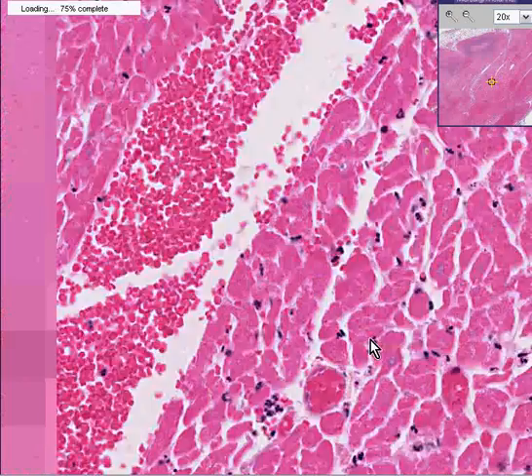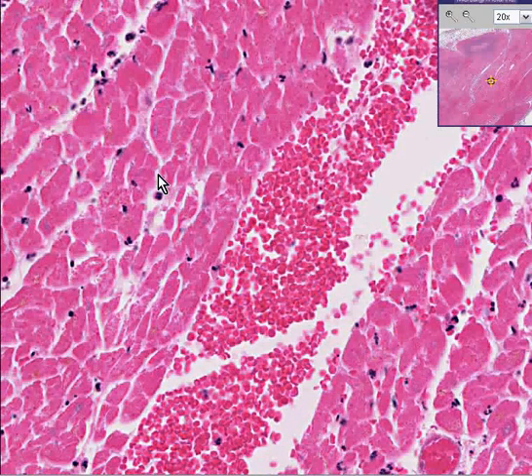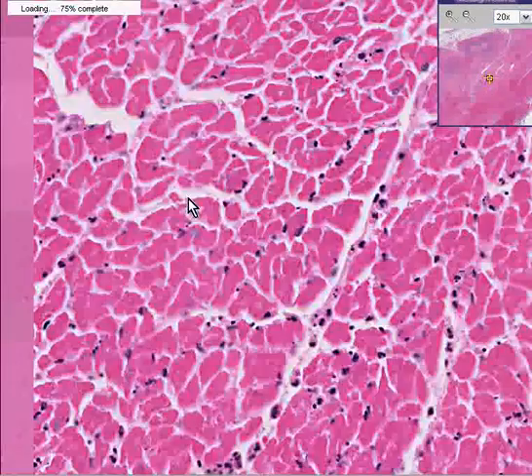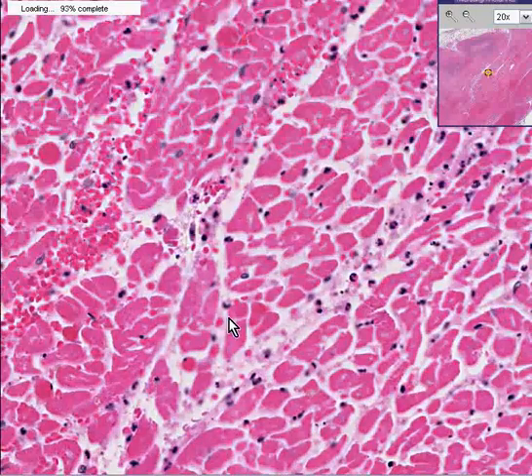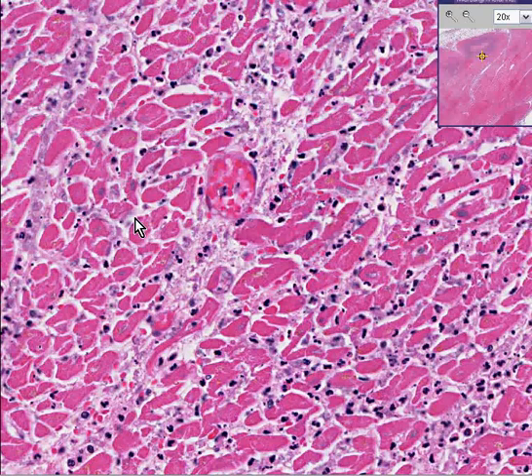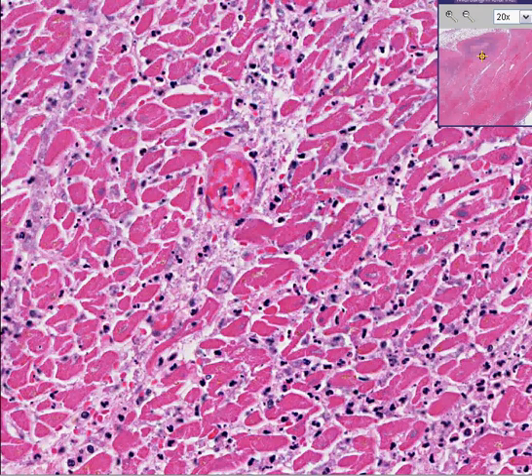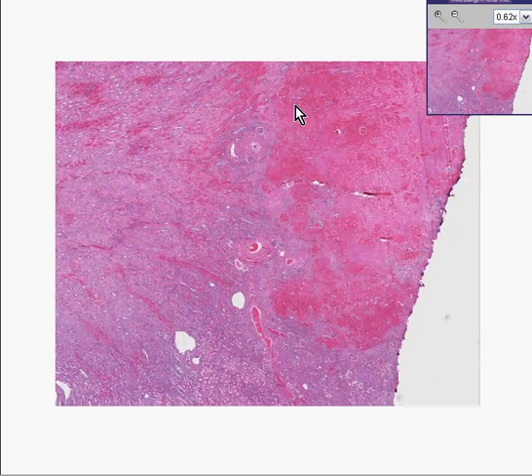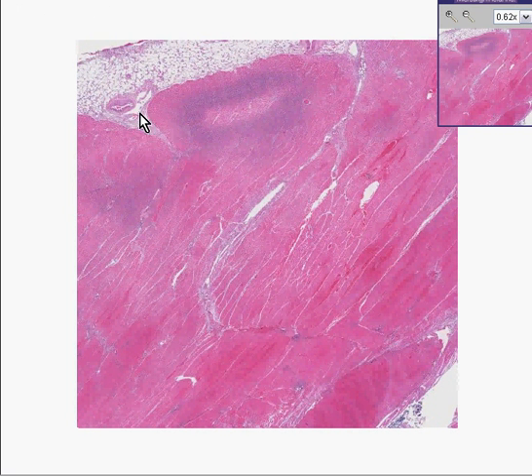And we also have a hard time making out nuclear detail as well. This is an infarcted myocardium, and it's an acutely infarcted myocardium because if you look in some of the areas, you can see very heavy infiltrates of neutrophils. So let's put this whole case together. We have an infarct of the kidney. We have an infarct of the myocardium seen most intensely here, but you'll remember here we had some infiltrates of neutrophils and hard to delineate nuclei as well.